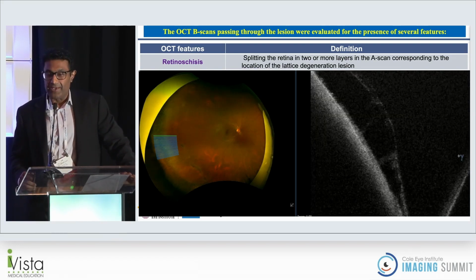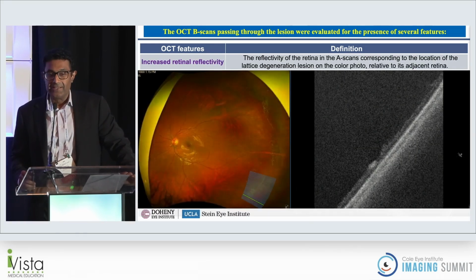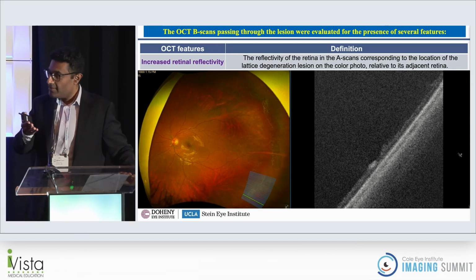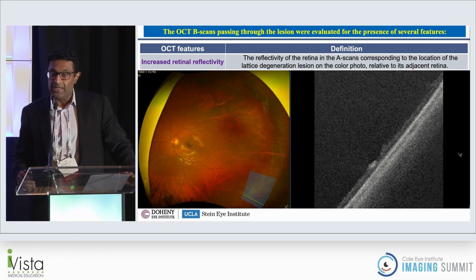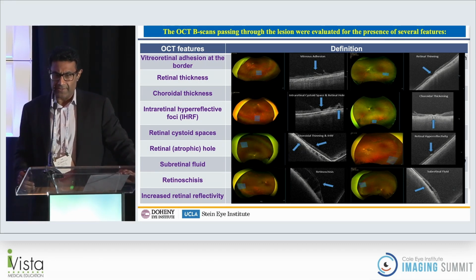So Amani is saying I just didn't do a good indentation exam on this patient. And then, of course, there's also, this I wouldn't call a hyperreflective foci, but we saw these interesting things where the retinal tissue was hyperreflective. I have no idea what that is, but that was not an infrequent finding. Well, I'd say it was less common than some of the other findings.